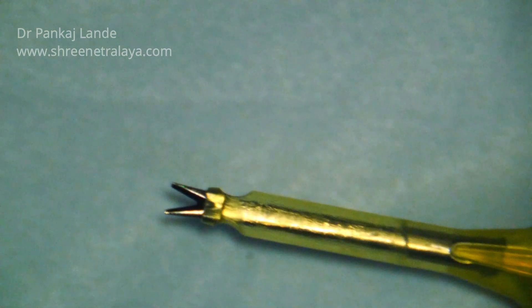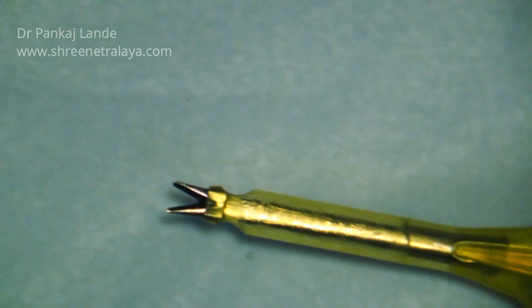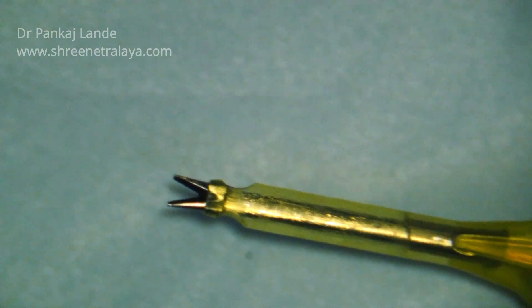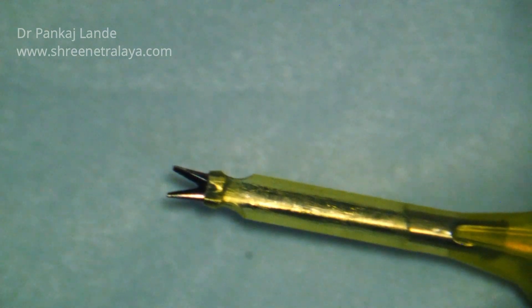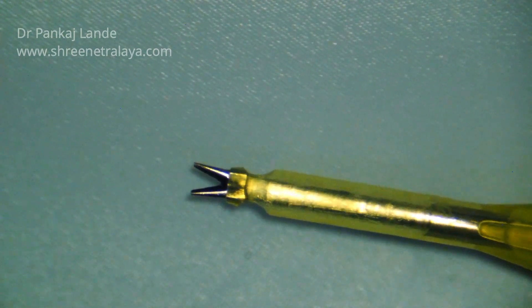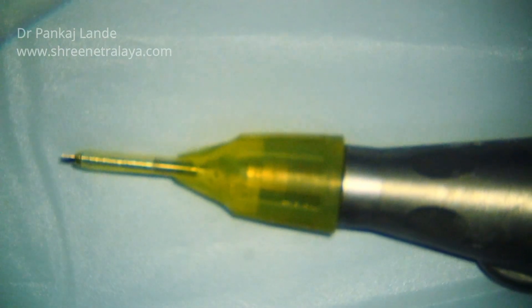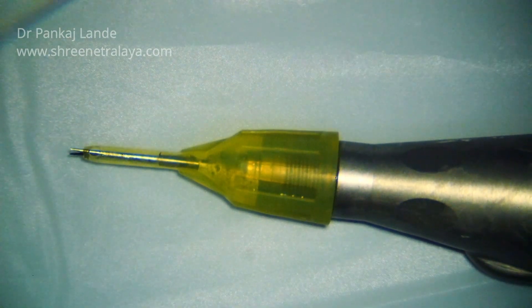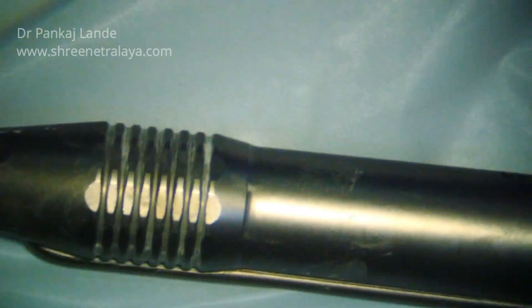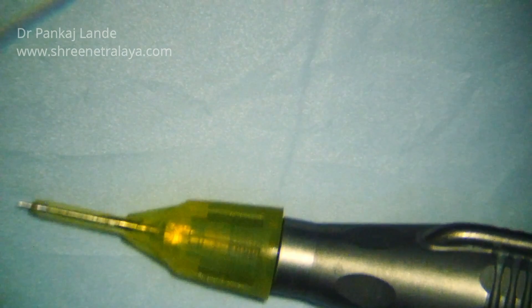Vacuum is not needed while performing pre-chopping with this tip, and because of this the aspiration rate has to be in the range where you can maintain your anterior chamber comfortably without having too much increase in your IOP. So it can be kept around 20 to 40, and with a vacuum of 0 — or some machines don't allow a 0 vacuum, so you can keep the setting to 5.